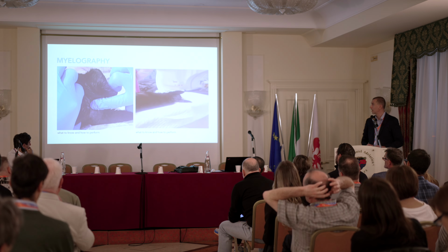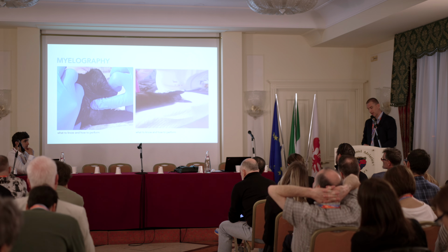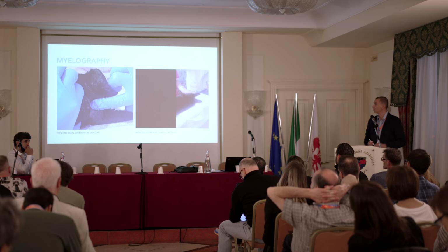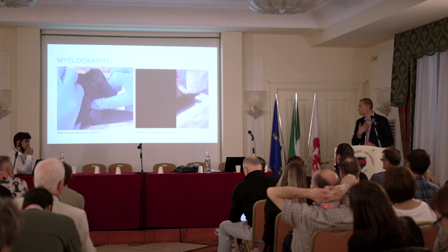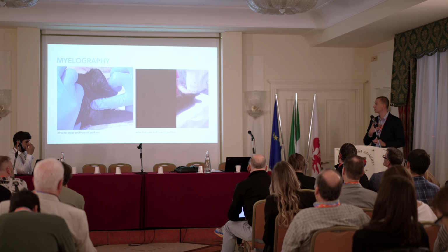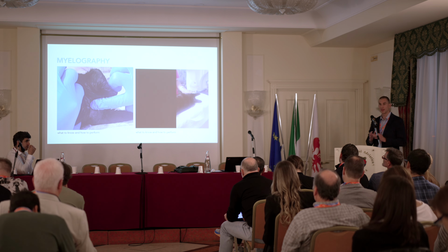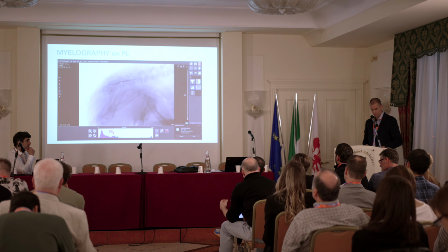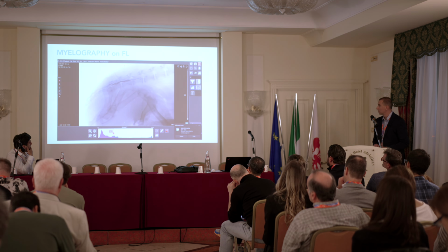So this is the same, and one trick of the application here is you have to move the head towards the chest, so that there is a big flexion, and then you can open the space for application. So this is other case of fluoromyelography.